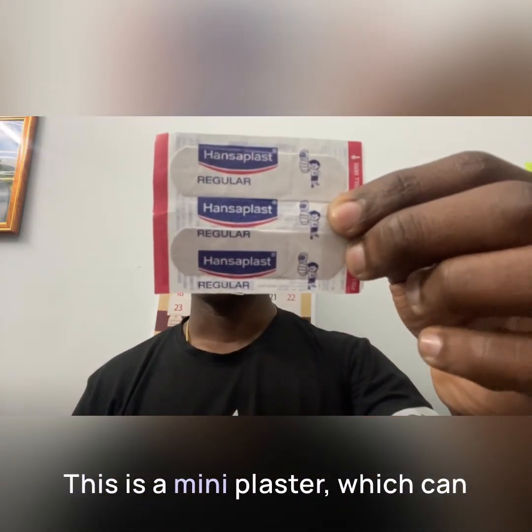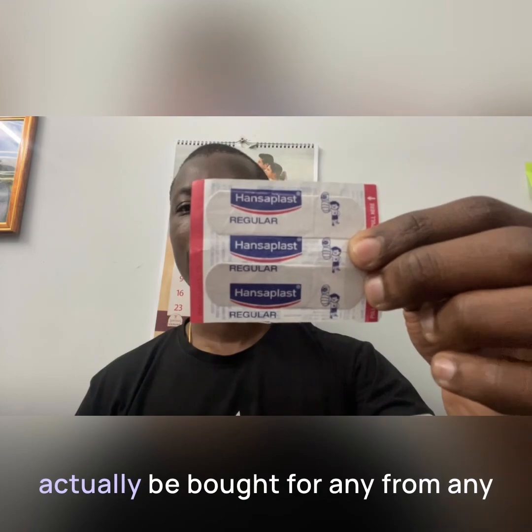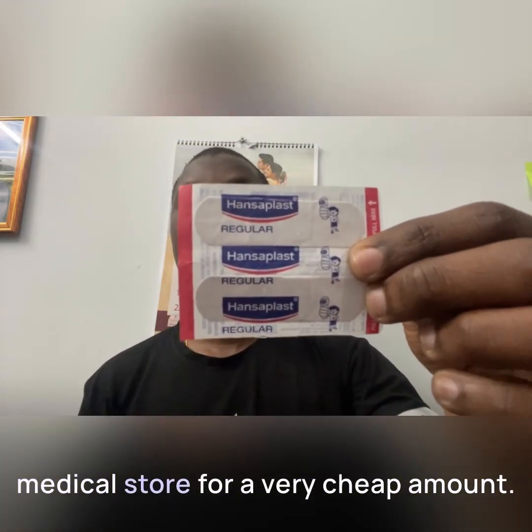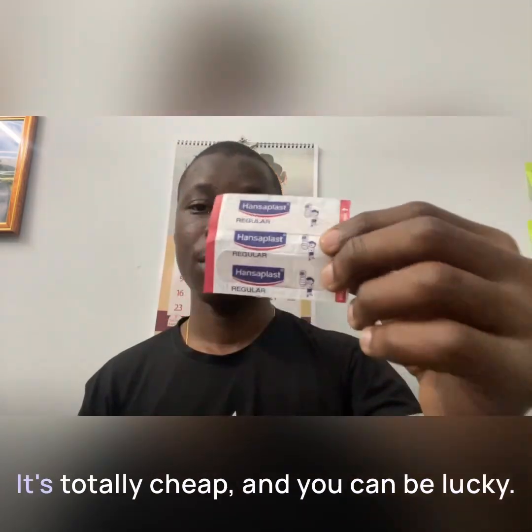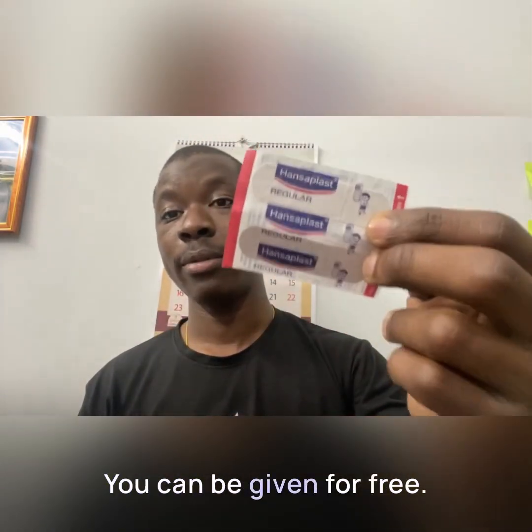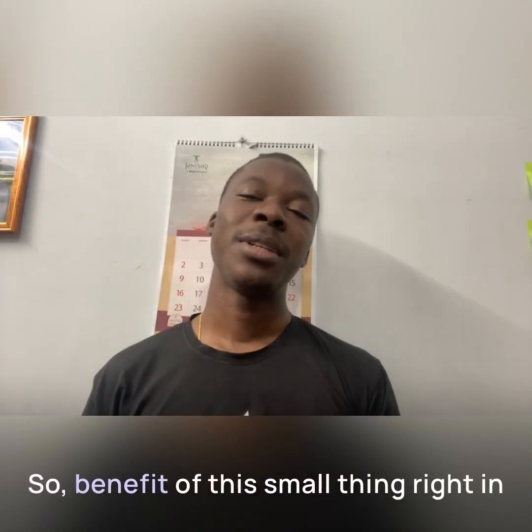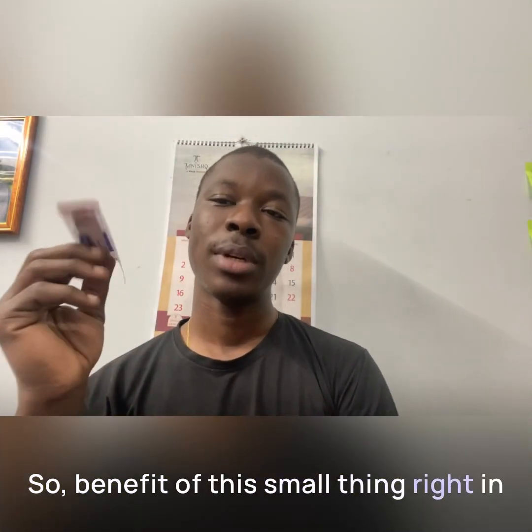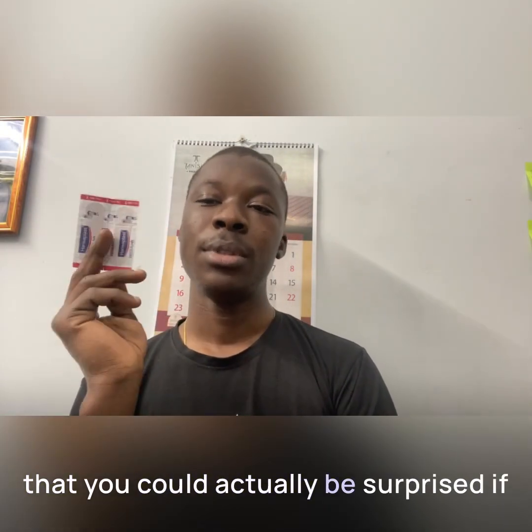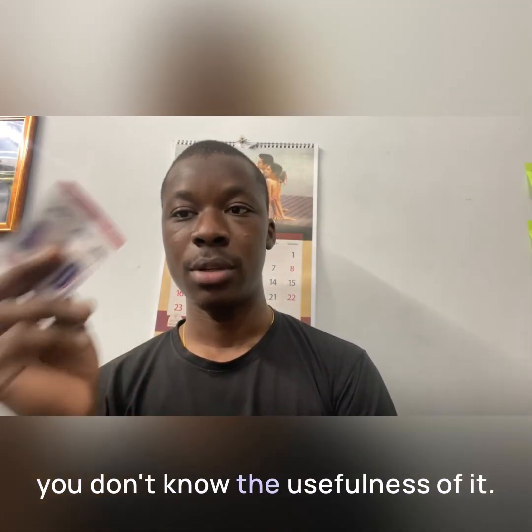This is a mini plaster which can be bought from any medical store for a very cheap amount. It's totally cheap, and you may even be lucky enough to be given it for free. The benefit of this small thing right here in my hand is so much that you could be surprised if you don't know its usefulness.